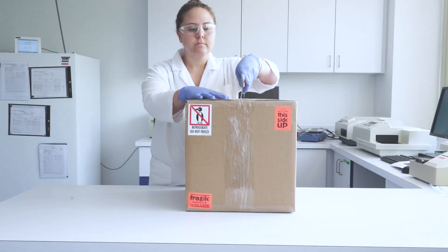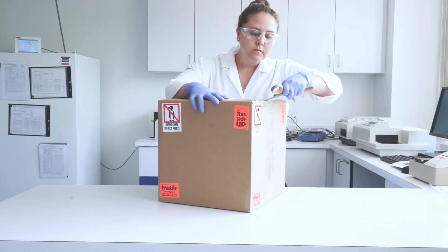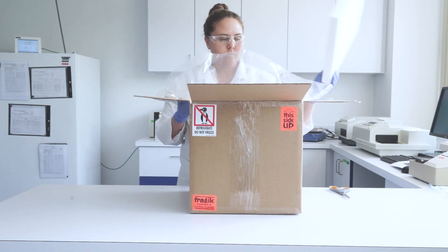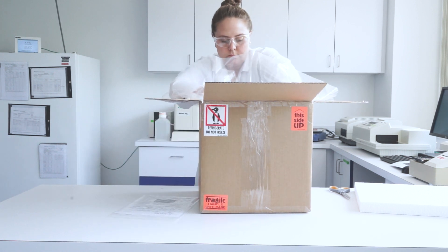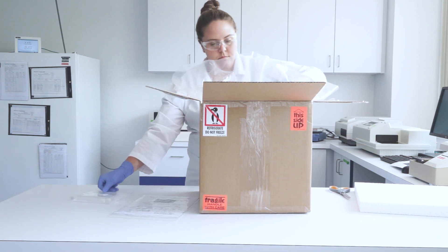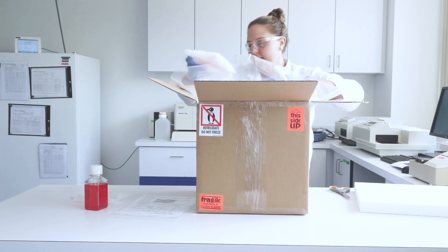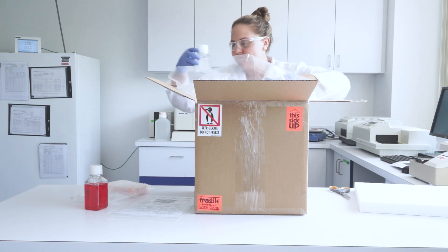Upon receiving your shipment, remove all kit components from the box. Each kit contains one Epi-Intestinal 196 tissue model for high-throughput screening protocol, one sterile 96-well receiver tray, one 250-milliliter bottle of maintenance medium, one Epi-Intestinal 196 tissue plate in a sealed 96-well plate, and one 100-milliliter bottle of PBS.